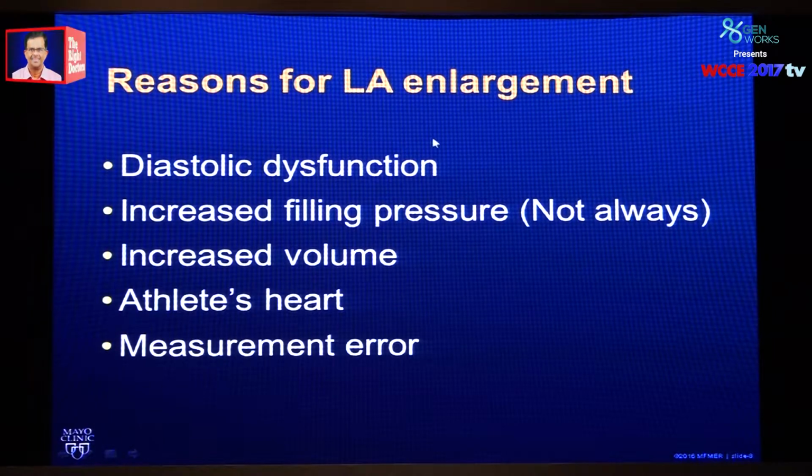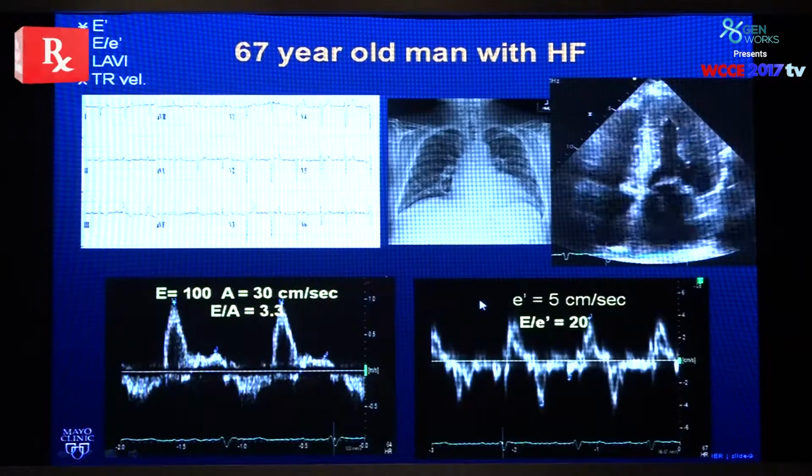So these are the reasons for LA enlargement. I just want to make sure that LA enlargement does not always indicate diastolic dysfunction. It can be an increased volume, someone with athlete's heart, or it can be measurement error. Just make sure that we measure the LA volume correctly.